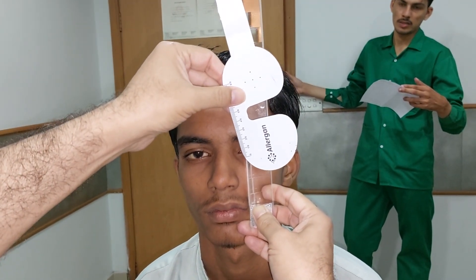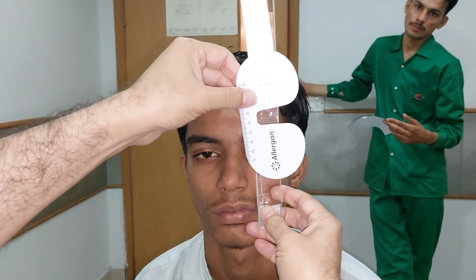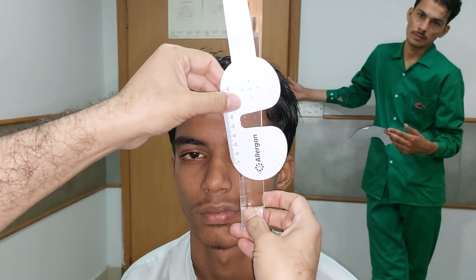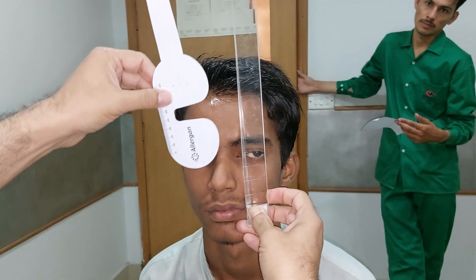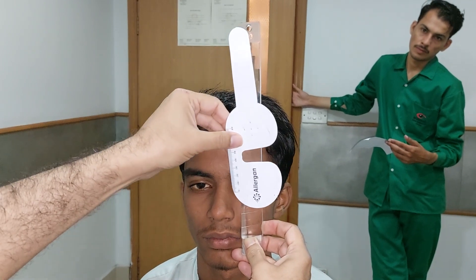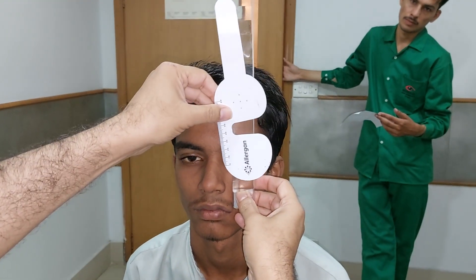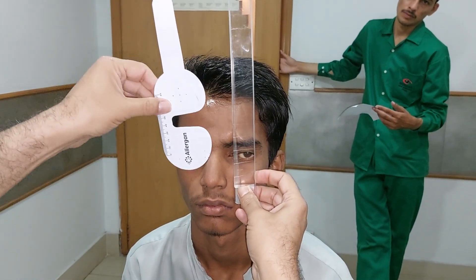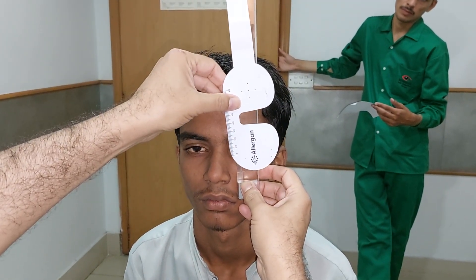Light ko dekhte rehen. (Keep looking at the light.)